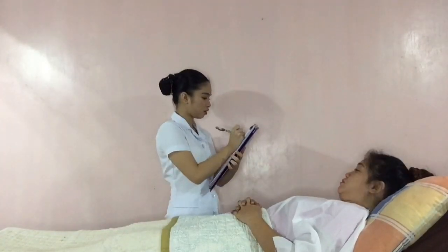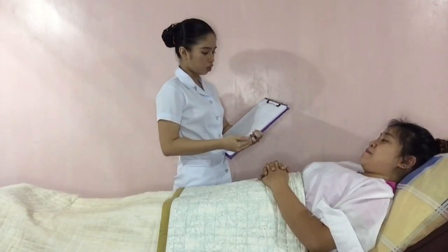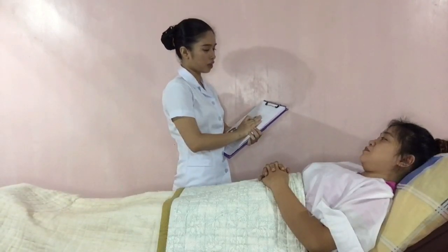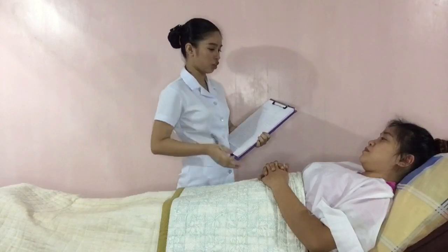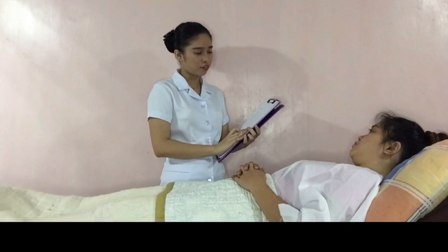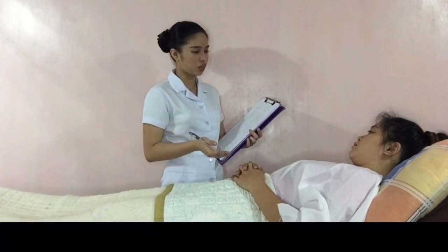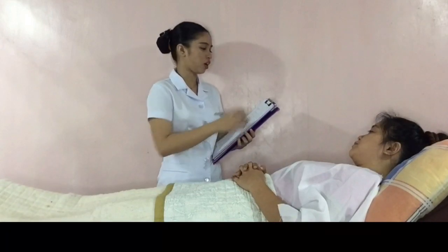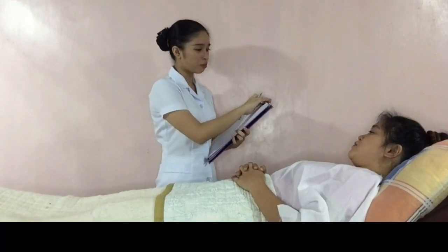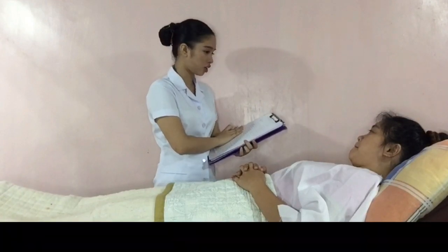Okay. So the procedure that I will be doing, ma'am, because you are unable to take the drug orally, is that we are going to give your medication through a subcutaneous injection. Do you have any clarification or concerns, or do you want to relax before the administration? As you can see, I've closed the curtain so that no other people can see us during the medication, and the information that I will be getting from you is secure. So let's start the assessment.